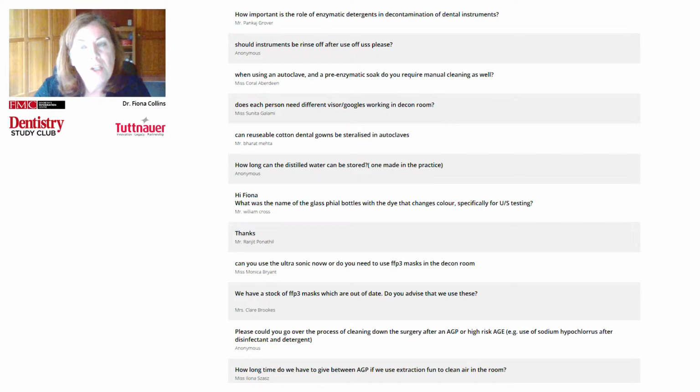In the alternative situation, which is an unfortunate situation, if soil or debris is already dried on, then you would want to check that it had actually moistened it enough to make cleaning possible. It's typically to prevent soil from drying on, and if that's the case, again, as soon as the ultrasonic cleaner or the instrument washer disinfector is available and somebody's available to perform cleaning tasks or manual cleaning, then you would remove it from the pre-soak or the immersion process.